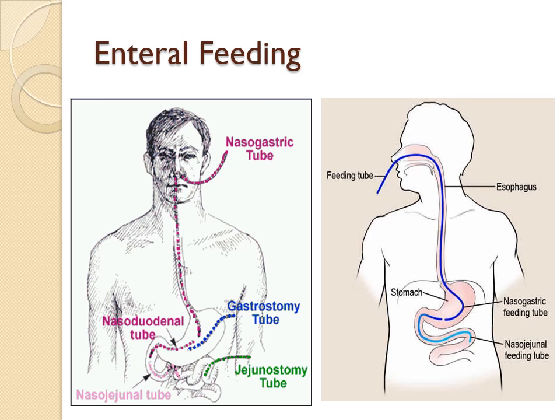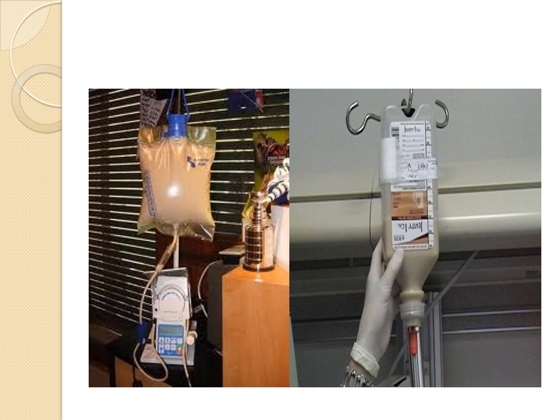Lastly, just to mention again, we had already talked about this in 110. As you can see here, these are bags that are going to be hung usually for a long time frame, anywhere from 10 hours to 20 hours. A lot of times now what doctors are ordering are bolus feedings, where the patient might get a can of their supplemental feeding about 5 or 6 times a day.